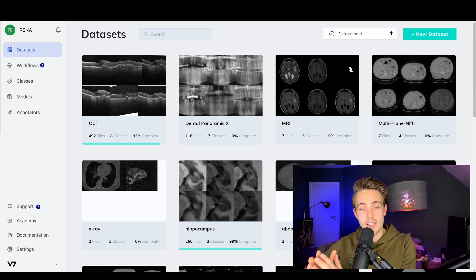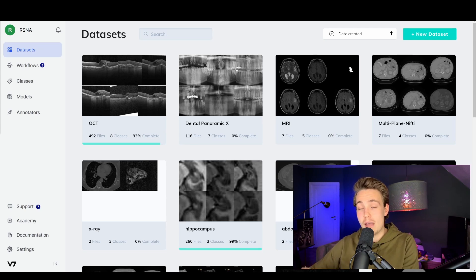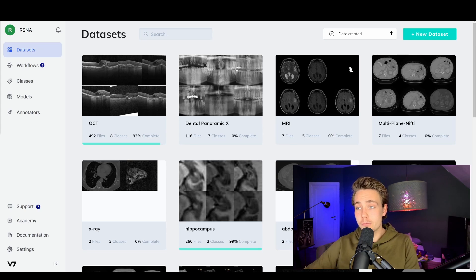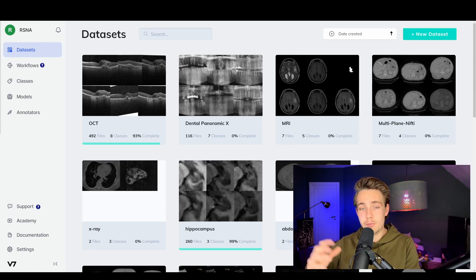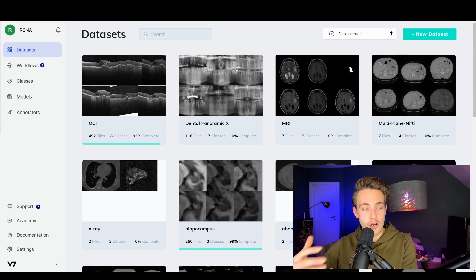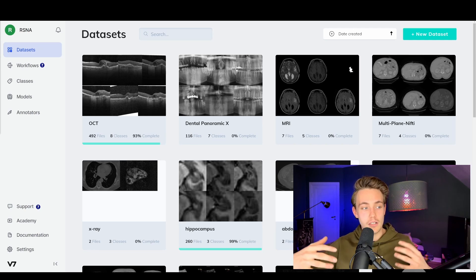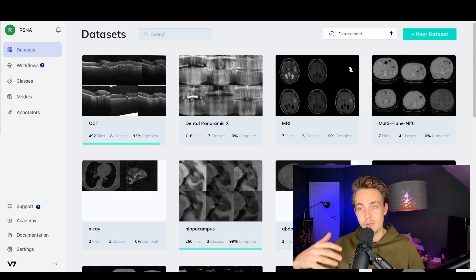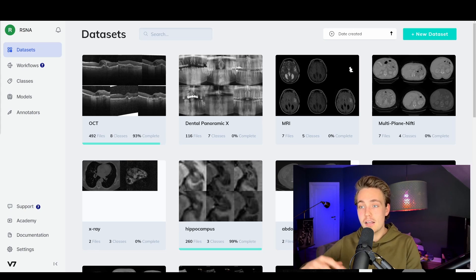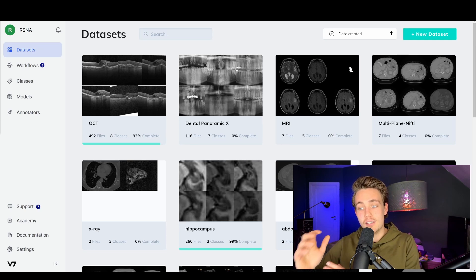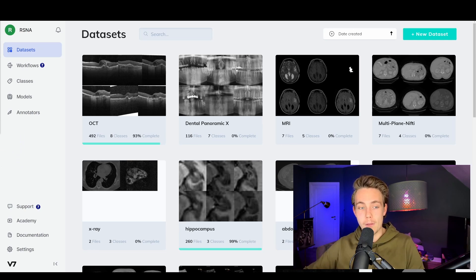We can load in files as videos and then annotate these files as a video. We can see how the brain or the heart is evolving or moving over time. Then we can correct our labels based on that and create a really nice dataset in that way.